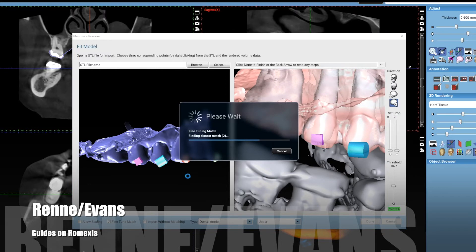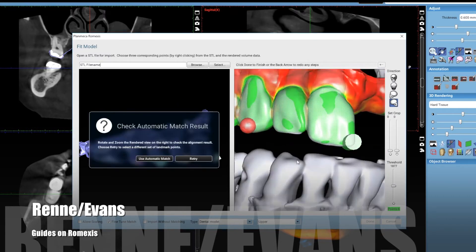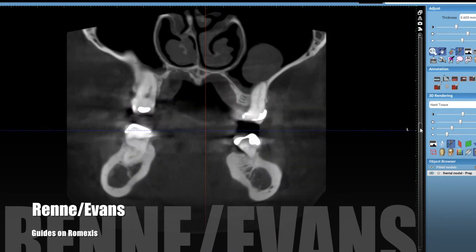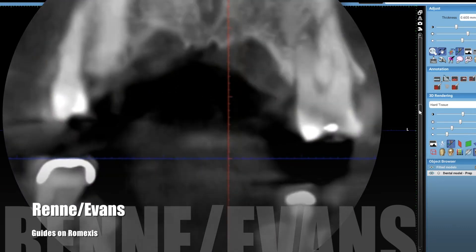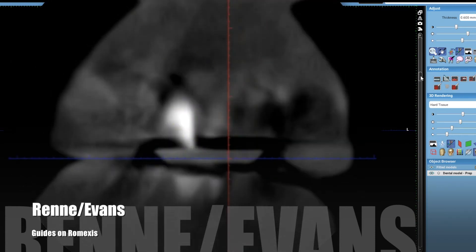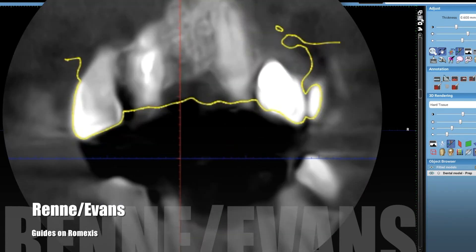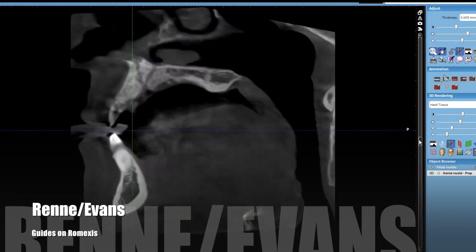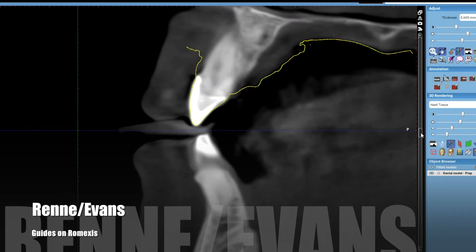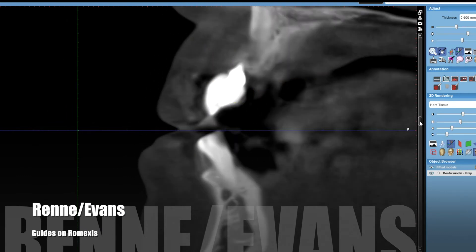From there you can select additional data points to further customize the fit and alignment of the models. When you hit accept, it does more mathematical calculations to make it even more accurate. In your XYZ cross cuts you'll have a very precise model alignment to the DICOM data. Make sure your alignment is perfect — triple check it in these various cross-sectional planes. You can't be too fast here.